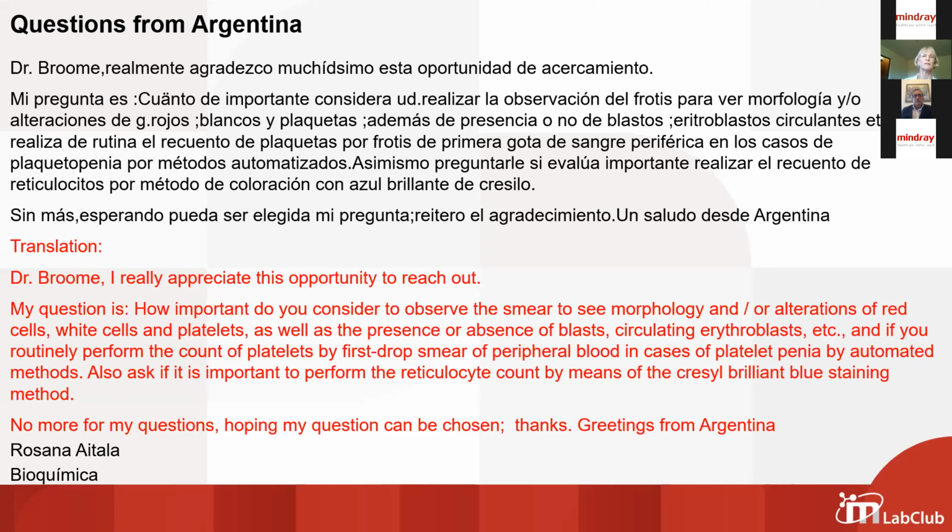We didn't really find that we were missing anything. So I would say it's very important to look at blood smears the first time you see a patient that has abnormalities, because in the laboratory, you're operating in kind of a vacuum. You don't know the patient history, you don't know what's going on. So you have to walk this line of looking at things, but not wasting too much time looking at them.